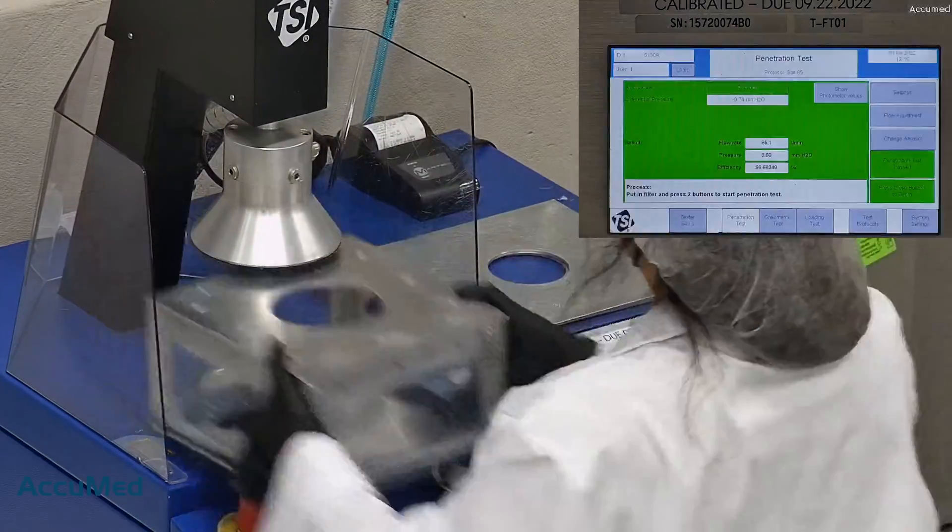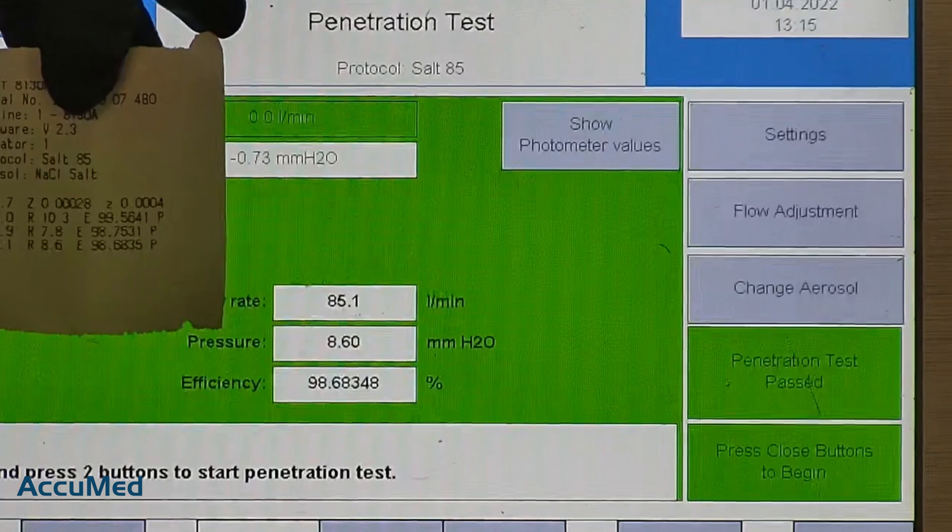Let's go over the results. F stands for air flow rate, which we test at 85 liters per minute. R is for resistance, also referred to as pressure drop — this correlates with breathability, so the lower the number, the more comfortable and breathable the respirator is. E stands for filtration efficiency percentage. Filtration percentage for all three samples was 98.68% or above. All of the respirators passed the filtration test, and they all had pretty good numbers. The pressure drop was all under 10.